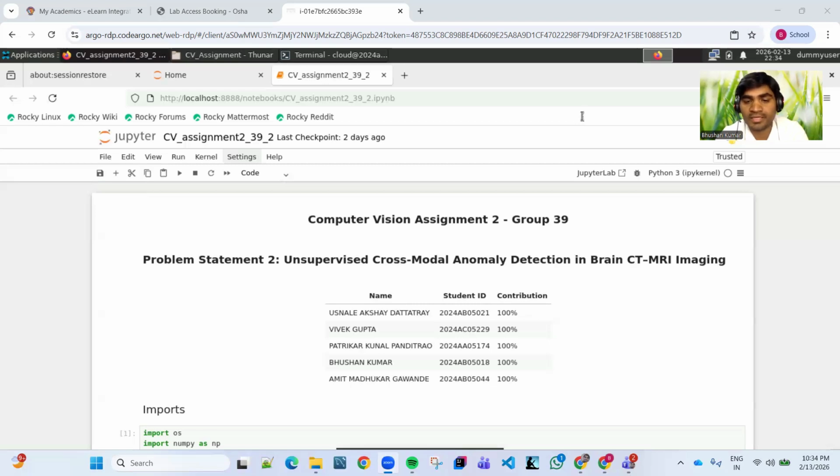As you know, a latent representation is the space where we reduce the dimension of the actual data we have. In every image, every pixel is one feature. Suppose we have a 256 by 256 image, there would be 256 multiplied by 256 dimensions. So it is a huge dimension. Now we want to reduce the dimension, so we use the latent representation and this autoencoder architecture.